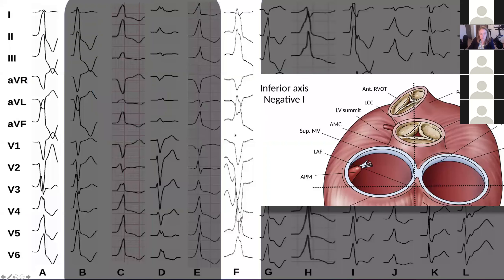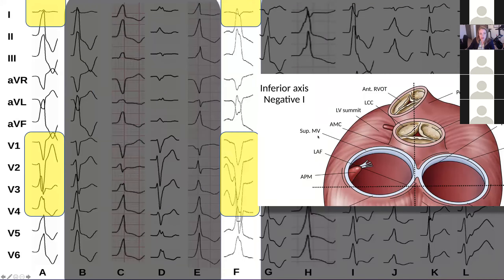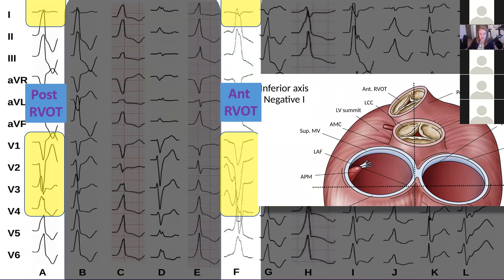Again, an inferiorly directed left bundle PVC, but this one has a very late transition. We can compare that to the RVOT PVC we saw in the earlier panel. We're seeing much more negativity up here — probably hidden underneath the zoom controls — but much more negativity in lead one at a very late transition. And that's going to be your anterior RVOT.